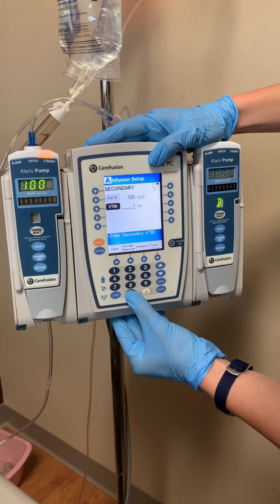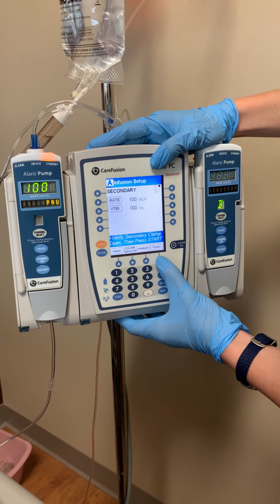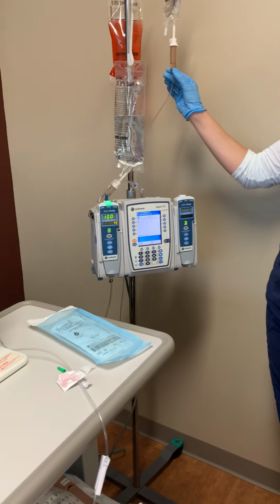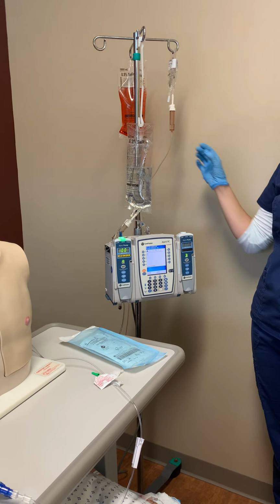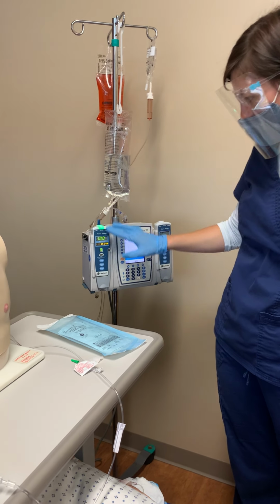And then I'm going to infuse all 100. At that point, it will switch over to my normal saline again. So I'm watching, and I do see that my potassium is dripping. I've counted 5 or 6 drips now, so I know that that is running. And everything was good there.